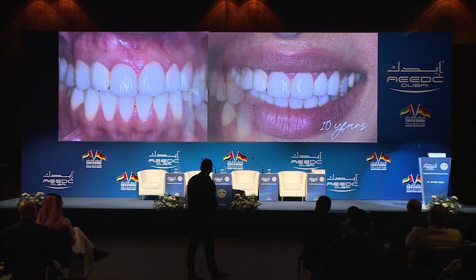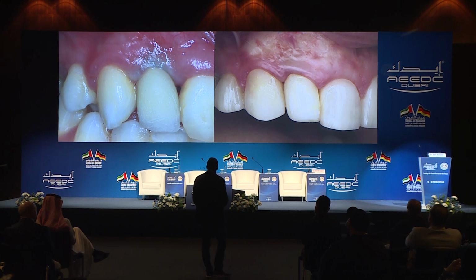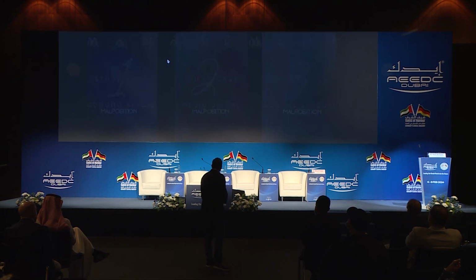And this is a 10 years follow-up. She's still there. And this is the 12 years follow-up. She's still there. Not the best implant, but she was okay. She was happy to maintain what we have with the bad implant placement. So let's jump to the last case.